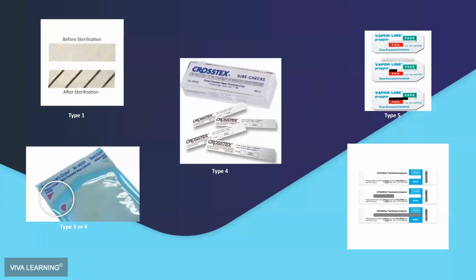Next question was spore testing. Do you run with an empty load or with a regular load? You run the spore test with a loaded sterilizer, and you follow the manufacturer's instructions for where you place that spore test. And what you're going to find is that the manufacturer of the sterilizer and the manufacturer of the spore test sometimes make different recommendations. And according to the AAMI Standard 79, follow the sterilizer manufacturer's instructions for where you place that spore test.